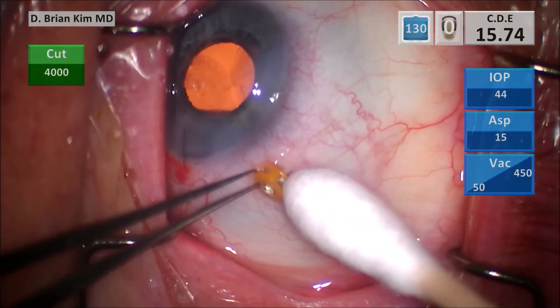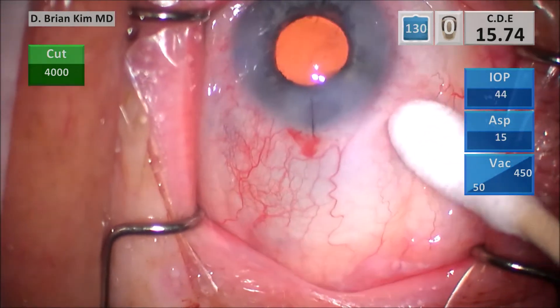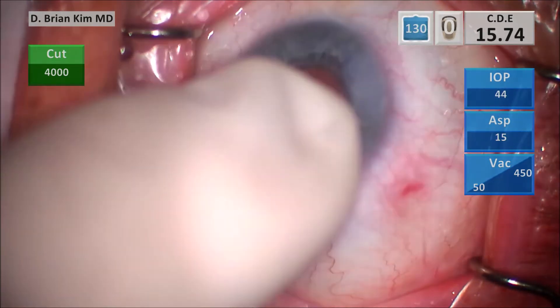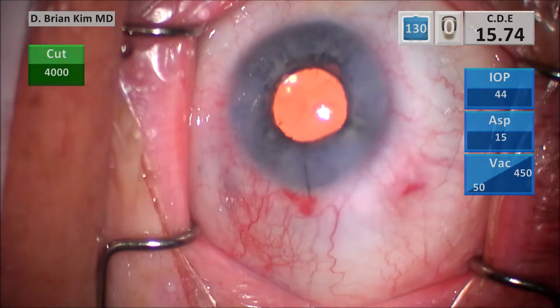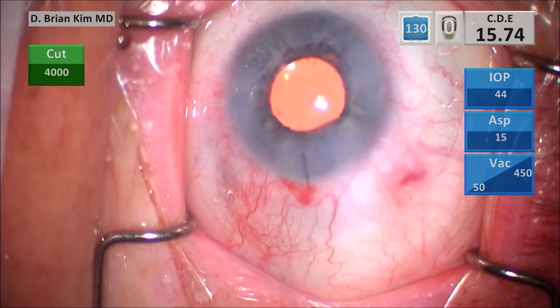Once I've filled the anterior chamber and the eye is nice and firm, I pull the trocar out and tamponade the sclerotomy with a cotton tip. There's no ballooning of the conjunctiva, which means I have a nice self-sealing incision. I fill the eye with more BSS, make sure I get physiologic pressure, and then inject subconjunctival antibiotics and steroids. That's the end of the case.